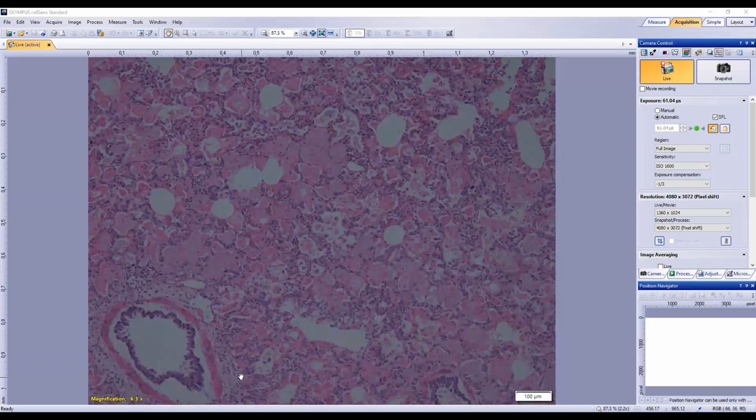So I would say it's both surfactant as well as the edema fluid. It's a mixture of these two because this is not entirely homogeneous. I can see here there is some more dense material, which I would say is surfactant, and it's been floating around with the mixture of the edema fluid.